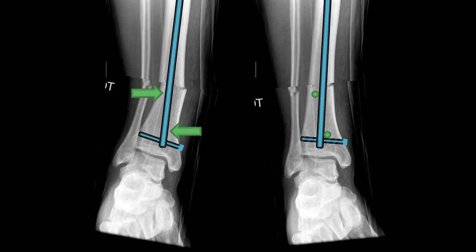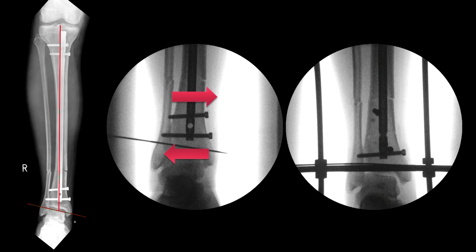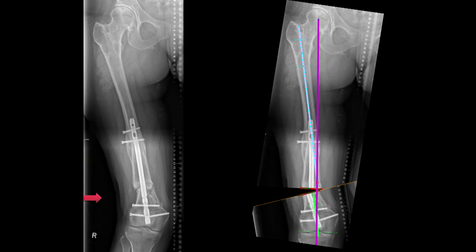Does that make sense? So schematically, if you have a bone in cross-section and the bone can drift across the nail on the locking bolts, what you've done is this, isn't it? And it blocks the fixation moving. Here's a very quick example of something I did in clinical practice, blocking screws top and bottom. The other thing that we'd planned with this case is probably a blocking screw, maybe even an additional plate.